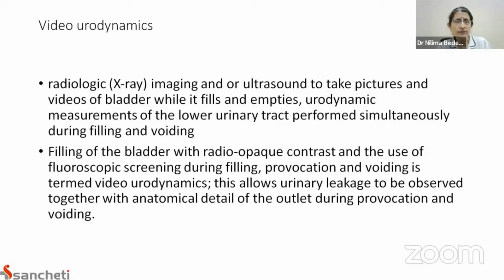Now video urodynamics or cystometry is sometimes considered very unnatural, and it may not give us the same picture as the person's regular response clinically, and hence it may not correlate a number of times.